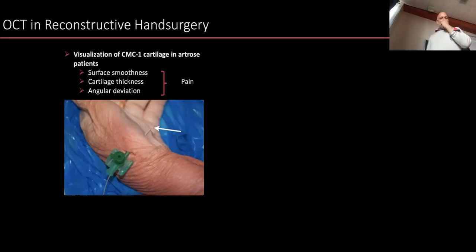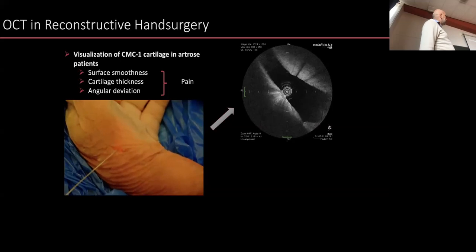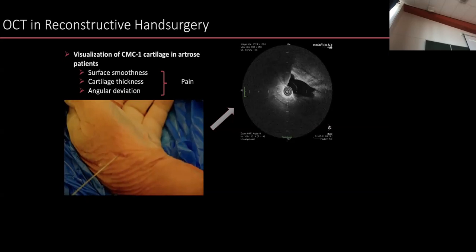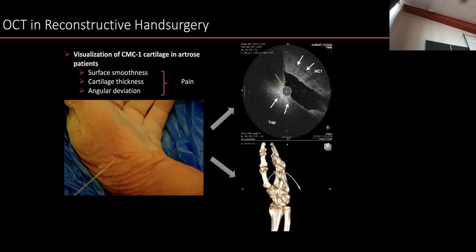And so we took a transparent needle trocar basically and squeezed it in there exactly in that position at the base of the thumb. We could leave this needle there because it's transparent. That helps a lot. It's not metal. And then we created imaging, and that's what you see here. So the OCT probe goes in there, and you see the data set appearing up there. It's not completely registered with each other, but at least it shows that here you see the normal appearing cartilage. It's just this beautiful layer on top of the bone, and here it is damaged.